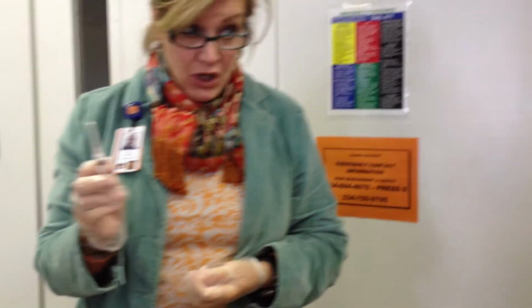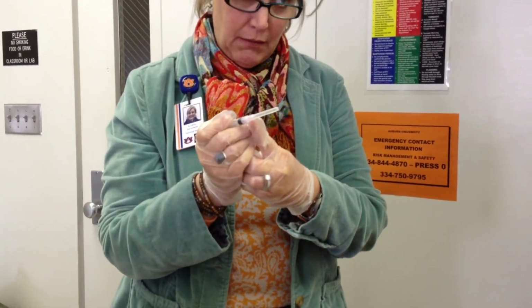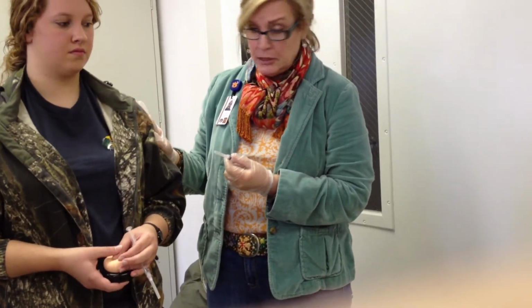So in other words, if I think, oh, that's about 2 inches or that's about 1.5 inches, I'm going to probably go a half inch higher than what I need, because if I don't get there, I have to use the whole length of the needle to hope I get there. So I'll choose a little bit longer than what I need. And likewise, the smallest one is like a half inch. If you've got a little 80-year-old woman who weighs 75 pounds and is atrophied, I would probably use no more than a half, and I'd search around to see where's the meatiest, most muscly feeling, because a lot of times muscles atrophy so much in old age.